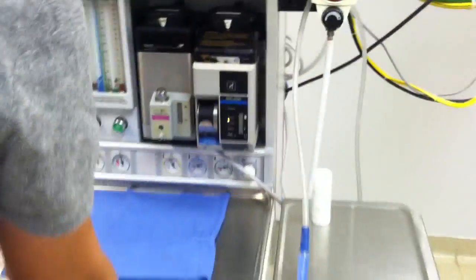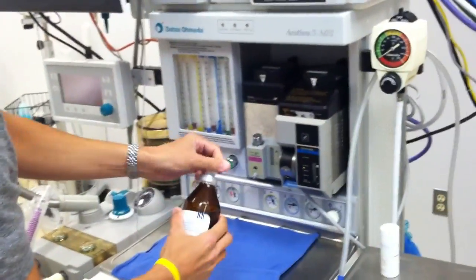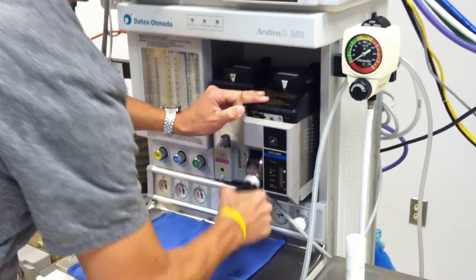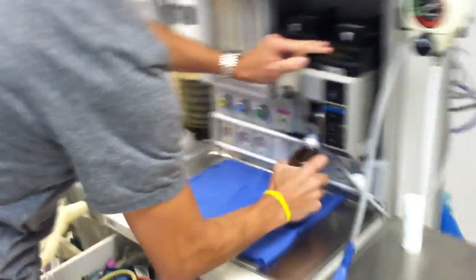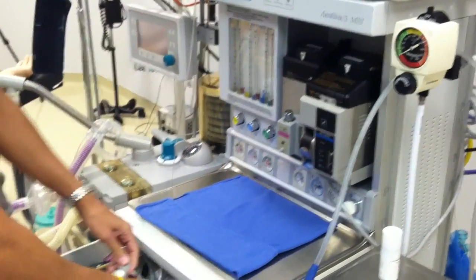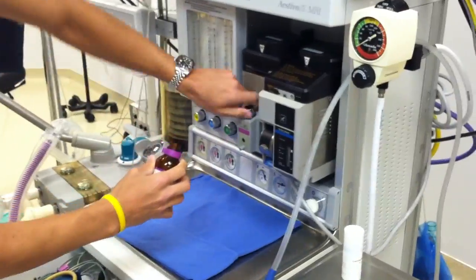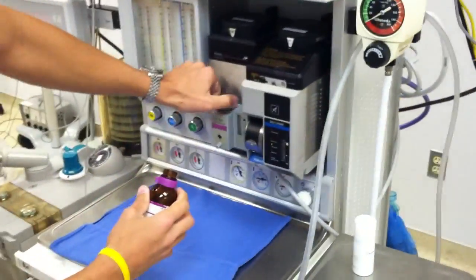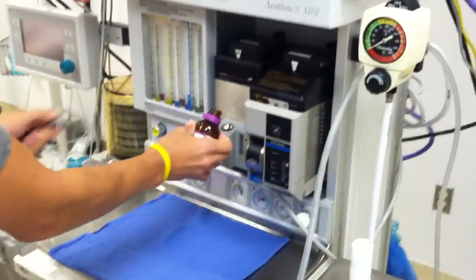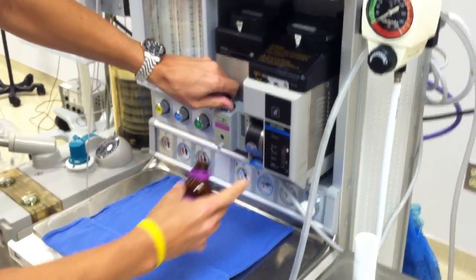Next, I want to go ahead and fill up my vaporizers. I have my DES here, which is a key fill system — sticking it all the way in. And I'm going to go ahead and fill up my ISO, which is a funnel fill system. Open it up — I want to do this before my low pressure check to make sure I don't have any leaks. Pour it in and just check your levels right there.